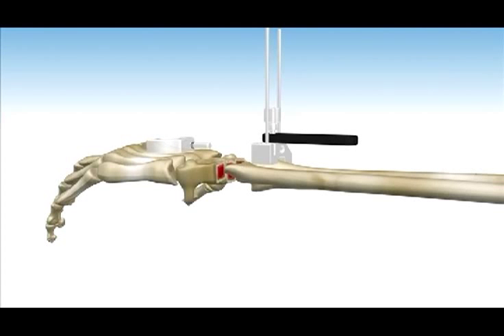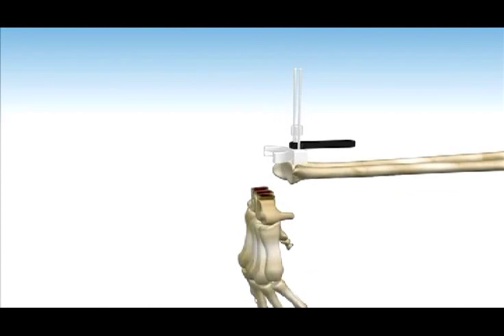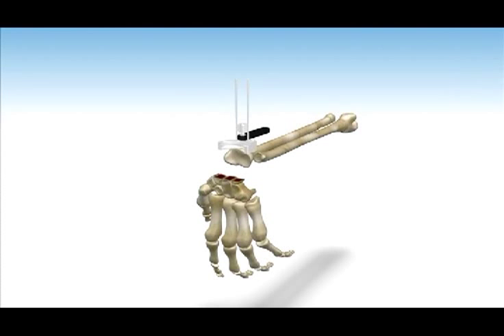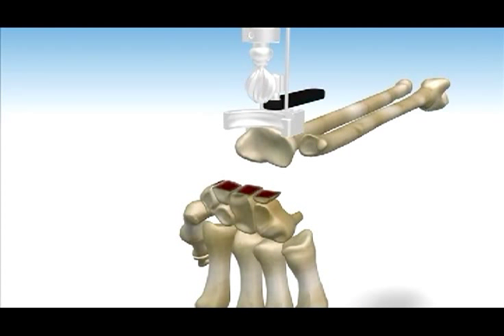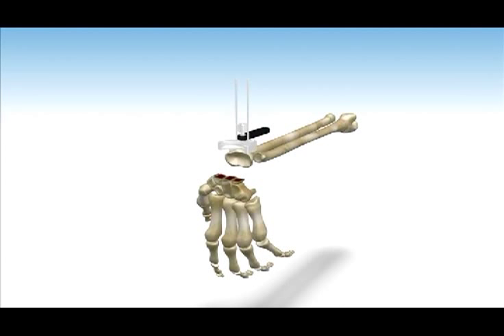Step 3. Insert the PGT radial resurfacing guide into the PGT guide. Tighten at the proper height to adequately contour the scaphoid and lunate fossa. The PGT radial bur should remove excess bone on the radial fossa and central ridge between the scaphoid and lunate fossa. Care should be taken not to remove too much bone and not to resect subchondral bone as a press fit application is desired. Remove the radial resurfacing guide.